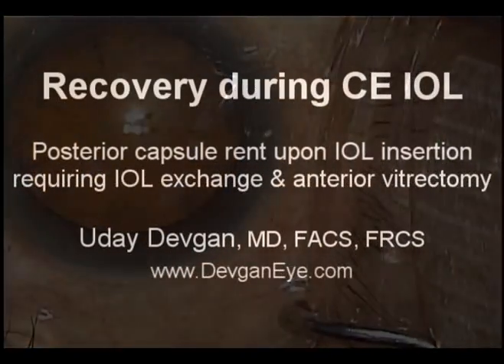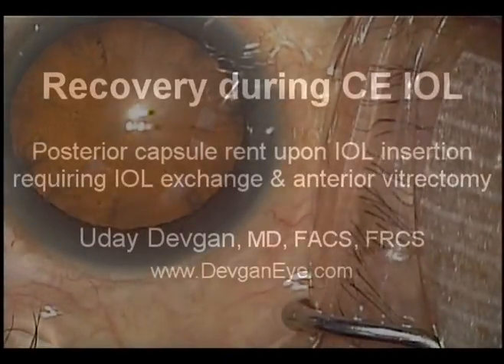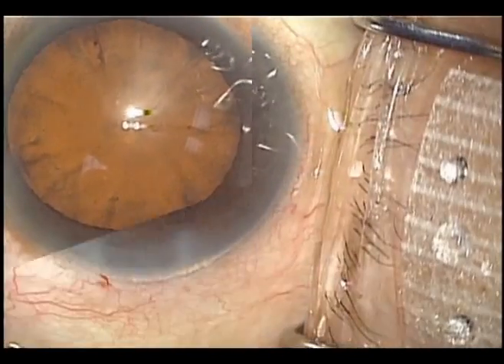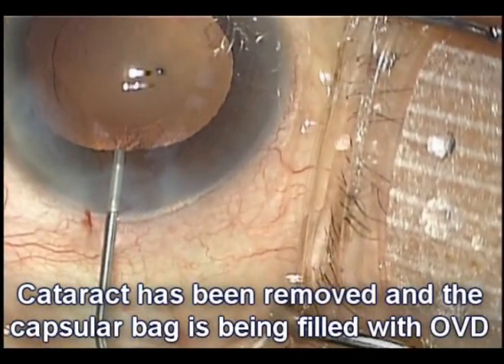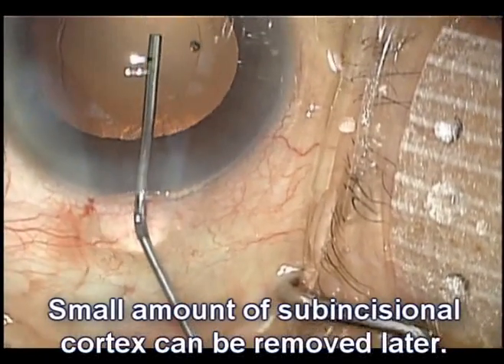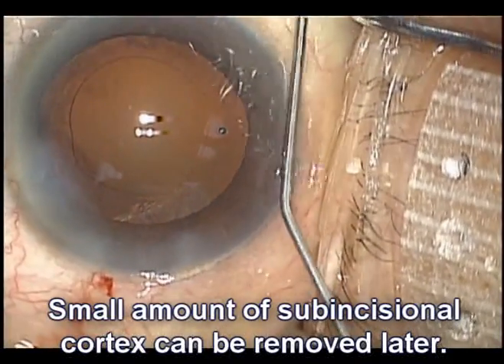A recovery during cataract surgery. This is a patient with a seemingly normal type of cataract surgery. Here's the cataract. Fast forwarding to the end, the capsular bag is now empty. We're going to inject some viscoelastic to inflate it. We have a very nice capsulorhexis. That sub-incisional cortex is very little — we'll get that out after the lens is in place.